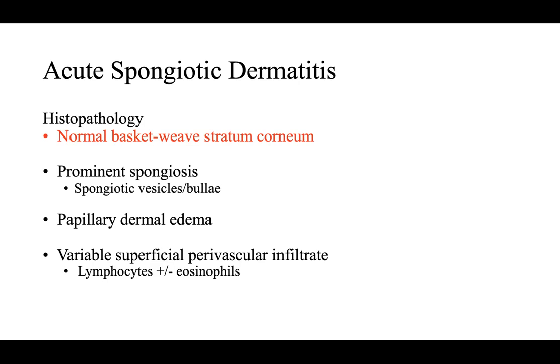So in this scenario where you're seeing epidermis with a lot of psoriasiform hyperplasia, but you see a lot of eosinophils, the patient's only on topicals for their therapy, you can start to imagine that that's probably just a subacute to chronic spongiotic dermatitis and not a classic psoriasis. So eosinophils can be helpful.